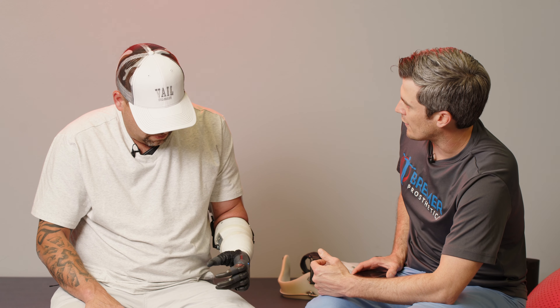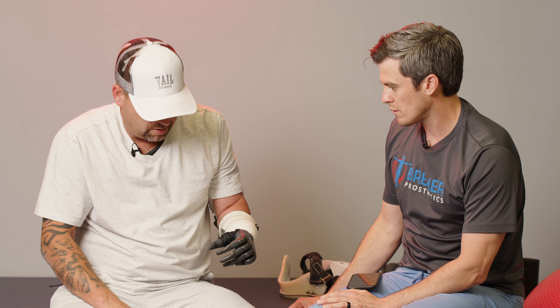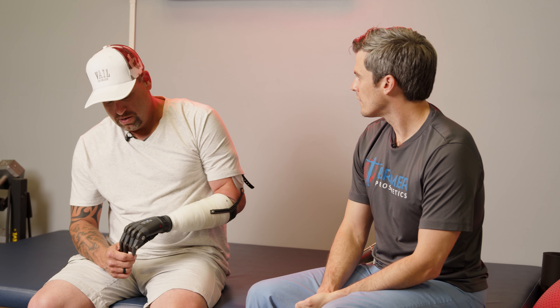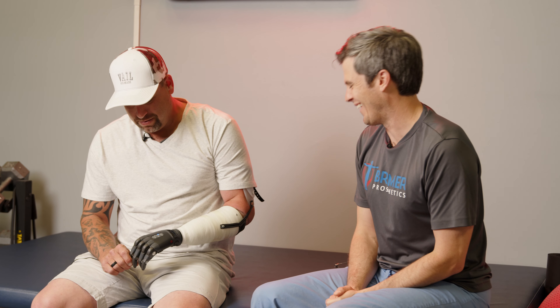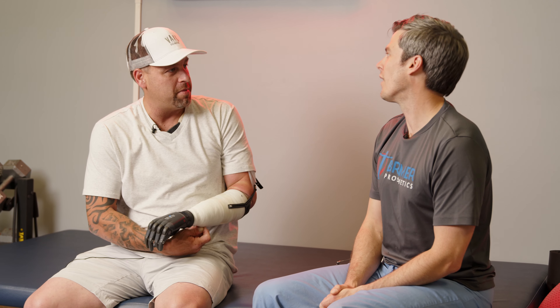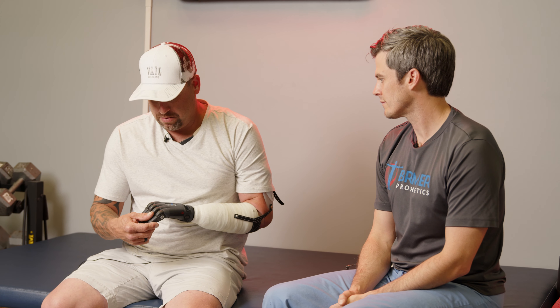How does it feel — is it easy enough to make it move? Yeah, because I can dial it and I can make it a little bit easier. It seems to be working pretty good really. I will probably try it for work some, but I'm probably just going to mess around with it for a couple of months, kind of just to get the feel of it before I take it to the job. Just because I'm so used to — I use that hook for a hammer and all sorts of stuff. I don't want to start just pounding it. But the thing is, with this I could hold a nail. I'm experimenting, just toying around with it.